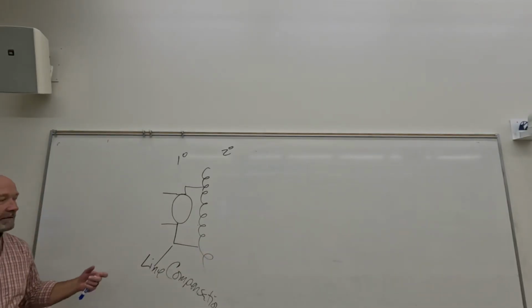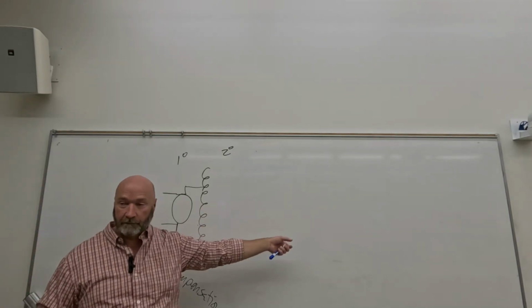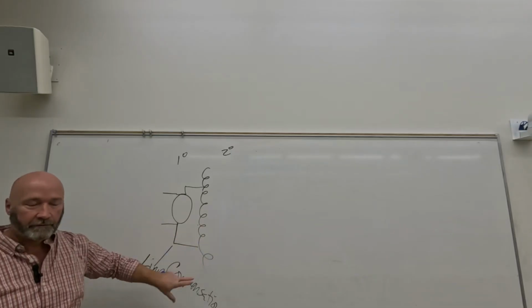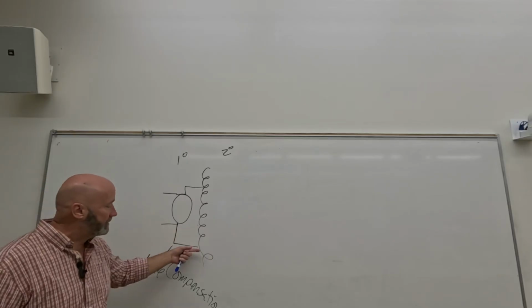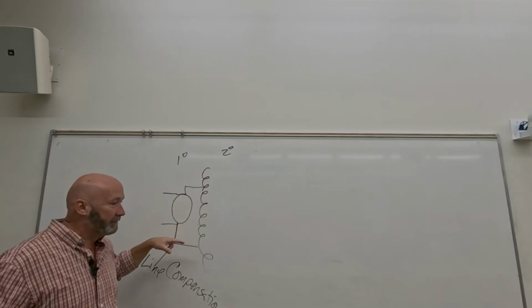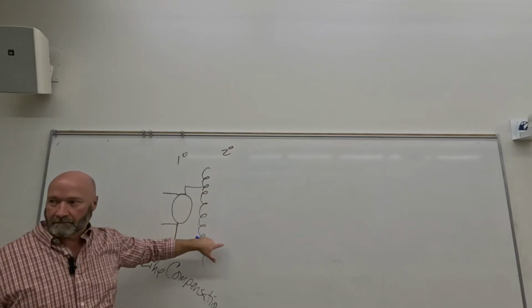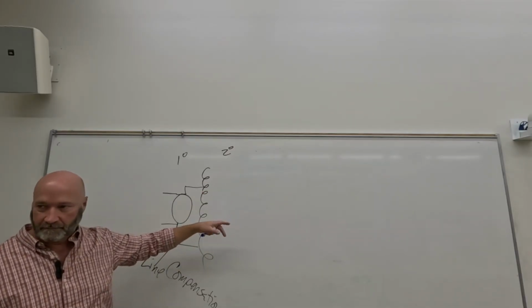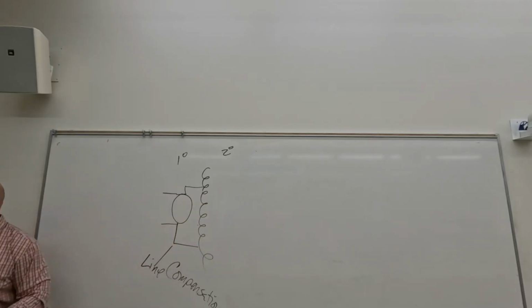It's important because the voltage that we have eventually is going to affect the kilovoltage that we have, right? We don't have kilovoltage yet, but if we know exactly what the voltage is that's coming into the auto transformer, then we know what voltage is going to go out of the auto transformer, providing our contacts are moving properly. Does that make sense? So we still have voltage at this point. So more on that here in a bit. All right, so that's the first thing it gets to.